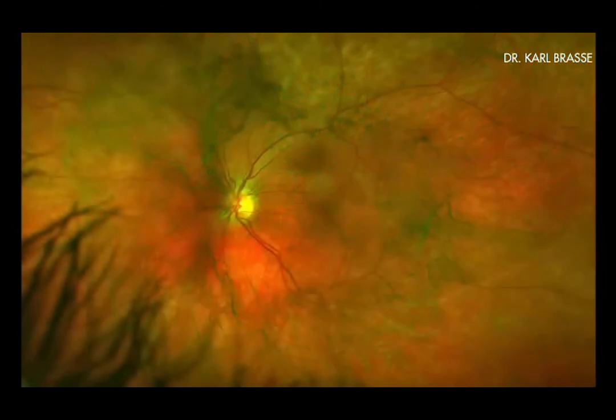I was kind of nervous when I applied his technique for the very first time, in particular in such a young patient. This Optos scan is proof of the effectiveness of the laser T membranotomy. I have split up this complex procedure into several sessions on 4 consecutive days. In total 10,000 millijoules of energy were necessary to succeed. This is almost 50 times the amount you need to perform a regular YAG capsulotomy.